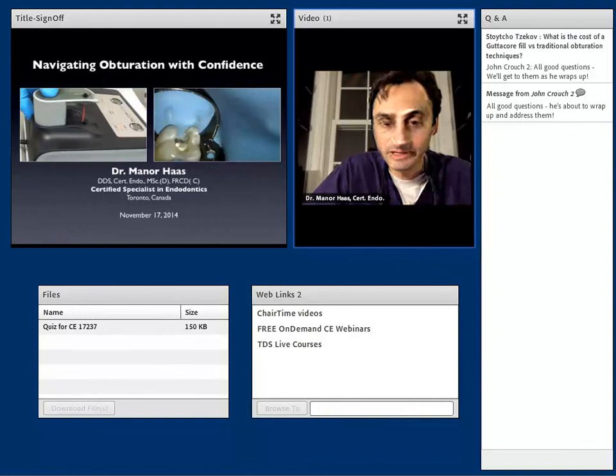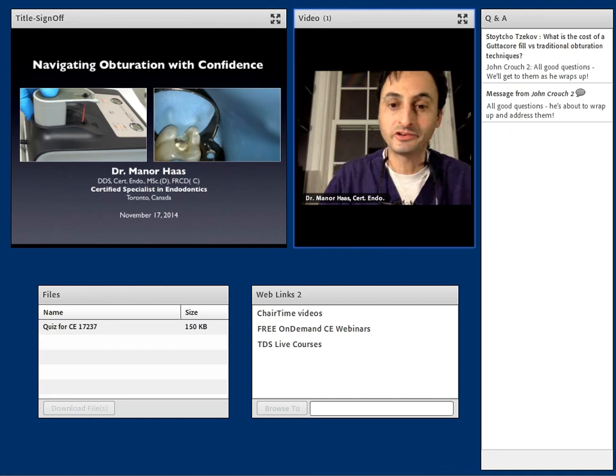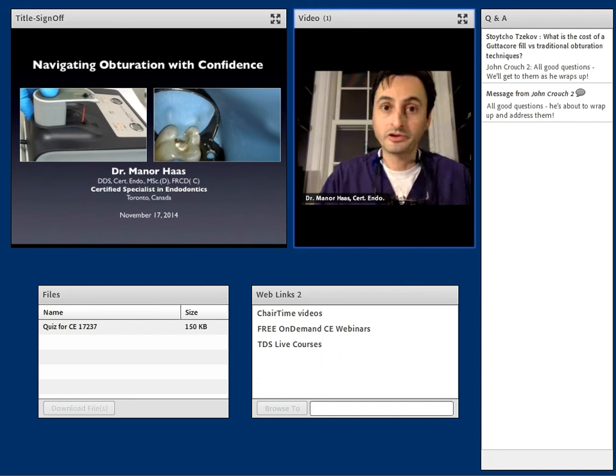A good question from Wilson. What happens if you meet resistance when inserting the gutta core as you keep pushing it apically? You might remember in the beginning of my presentation, I said one of my favorite things about gutta core is that if you do place too much pressure, it's all gutta percha, instead of the plastic carriers, where you're going to shove that plastic carrier in there, make that thing fit, and take up that space no matter what, and then be more likely to extrude stuff out the apex.